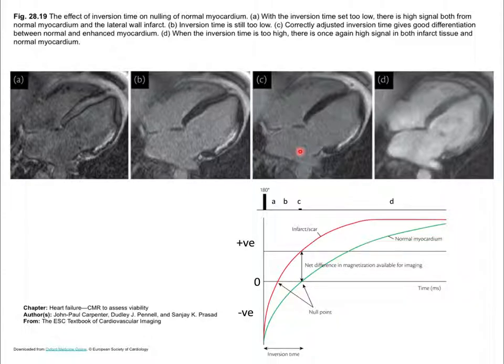And so you don't really need to determine where it crosses 0, because all of this contrast is quite constant over a broad swath. So if you can do a phase-sensitive reconstruction, you can achieve the same image here, here, here, here. And so certain manufacturers have pushed towards that. For example, Siemens does it traditionally, GE does not. And so you're stuck with finding out where the null is.